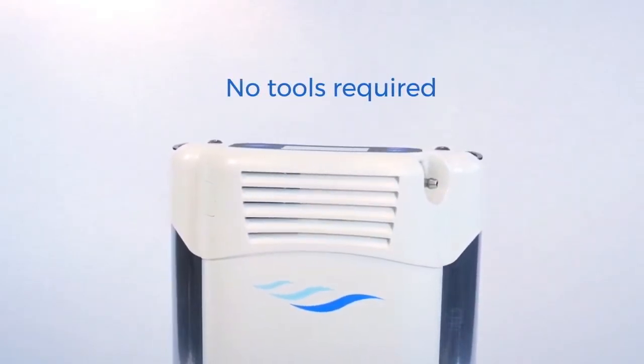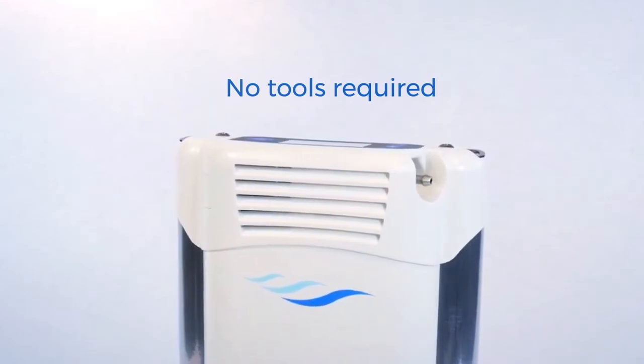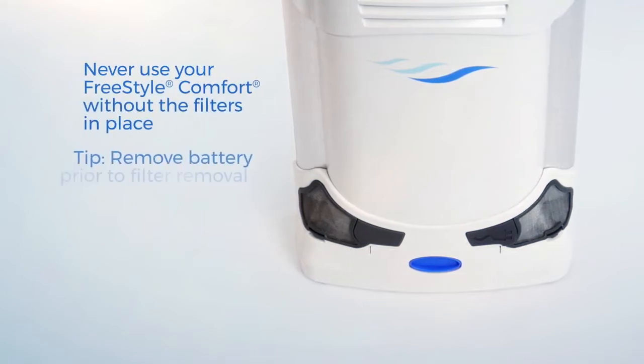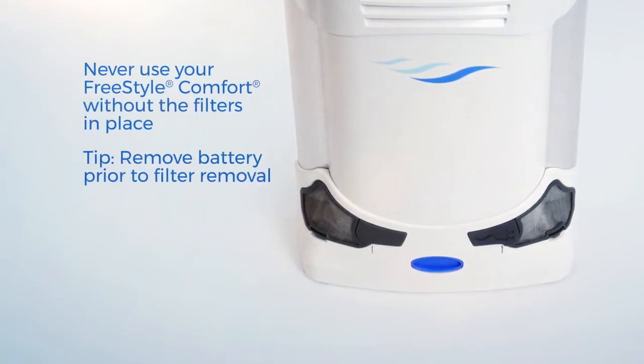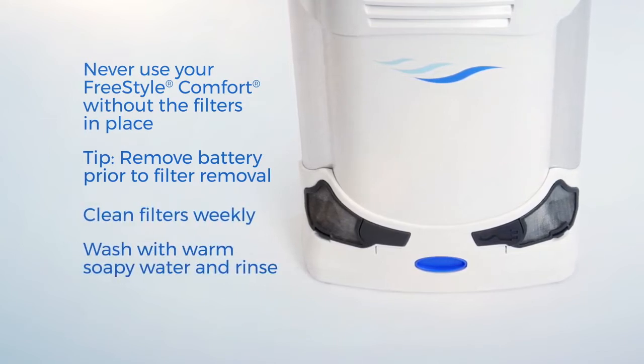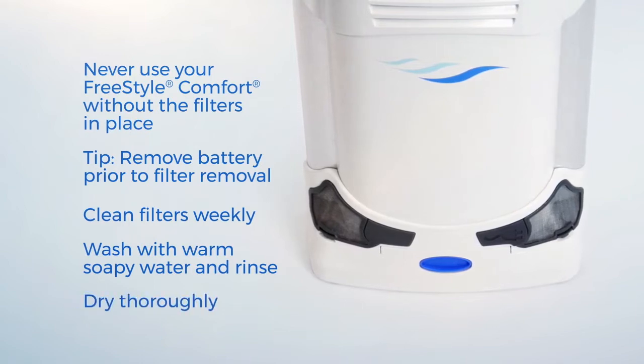Once you have removed the Freestyle Comfort from its box, ensure that the external gross particle filters are in place. Do not operate your Freestyle Comfort if the filters are not in place. It is recommended that you clean these filters each week by simply wiping them with warm soapy water, rinsing with warm water, and then allowing them to dry thoroughly before replacing.